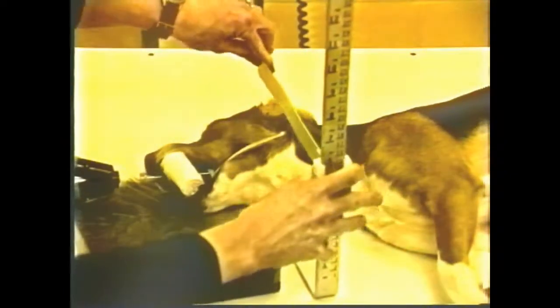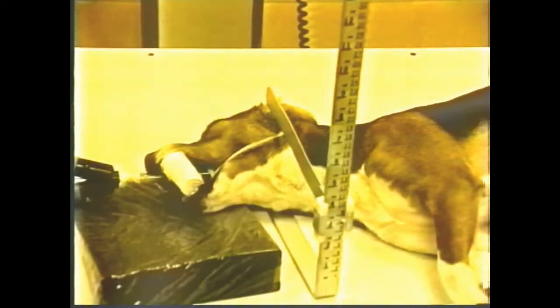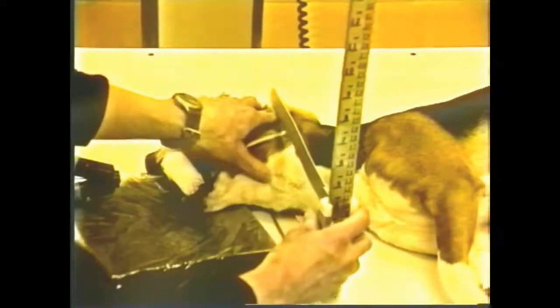We are now measuring the animal. Note that the ear must be removed so it does not add density over the skull during the radiograph. The measurement was made at the thickest part of the skull. We are now collimating down to the area of interest.